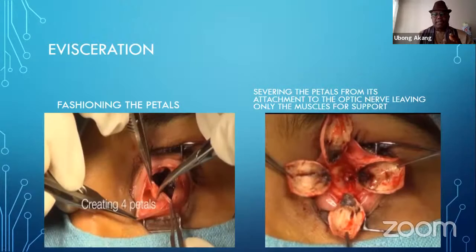If you don't want to enter into trouble in your surgery, anything more than size 18, you cannot be too sure that the patient will not bring the implant the next day and show it to you. And so you want to increase the space so that the implant will stay snugly.